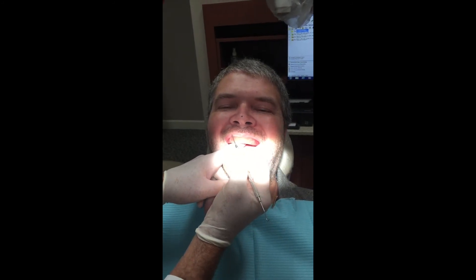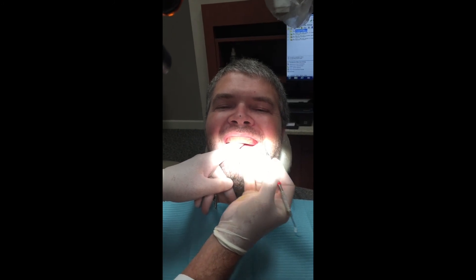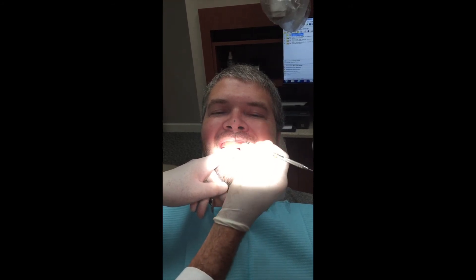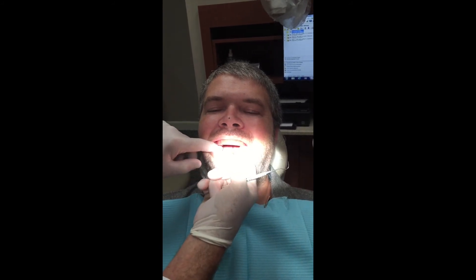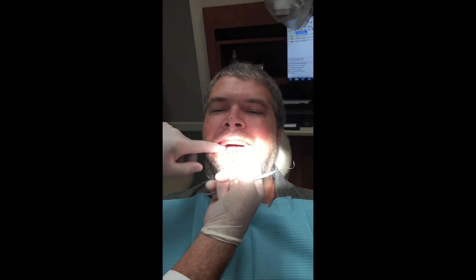At the high smile line, we mark that right at the lip line or even a little above it and we connect from the cuspid lines. That gives the lab exactly — this is the midline. Don't just use the tip of the nose; always use the middle of the lip there and mark the cuspids. We're also looking at the occlusal plane, and this wax rim fits his occlusal plane.